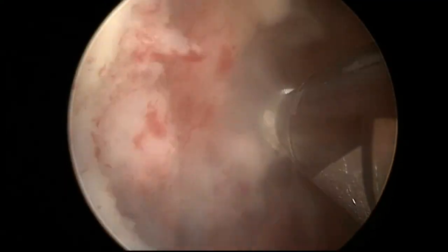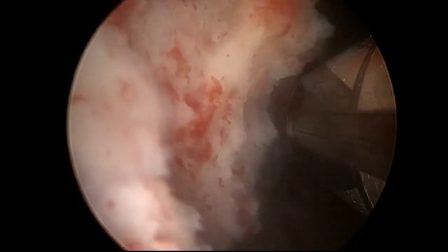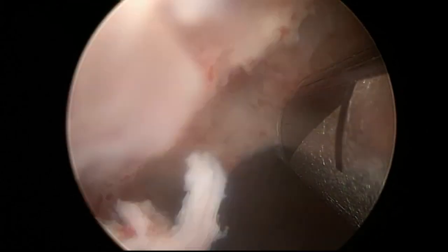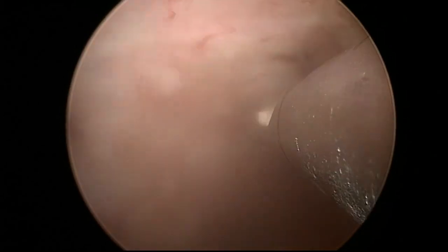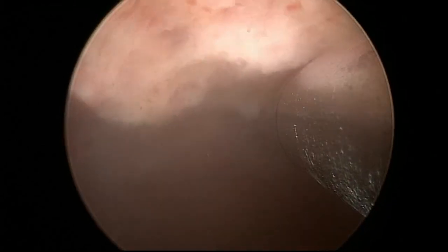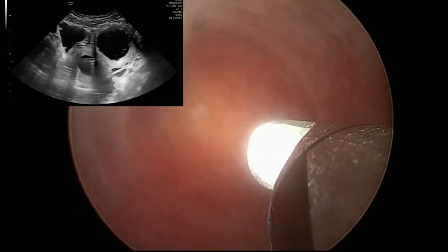The 6 mm tissue retrieval system is also introduced into the uterine cavity using the vaginoscopy no-touch technique. Selective removal of products of conception is performed under direct visualization, avoiding damage of the surrounding tissues. Direct visualization of the uterine cavity allows selective removal of products of conception, avoiding unnecessary curettage of areas where products of conception are not implanted.